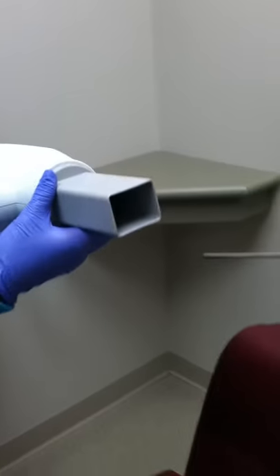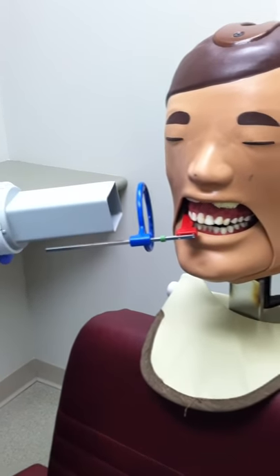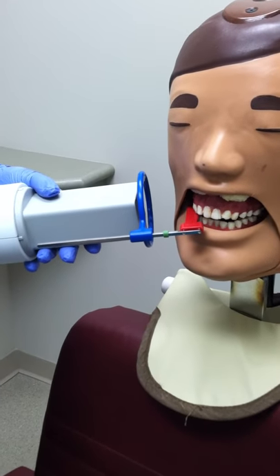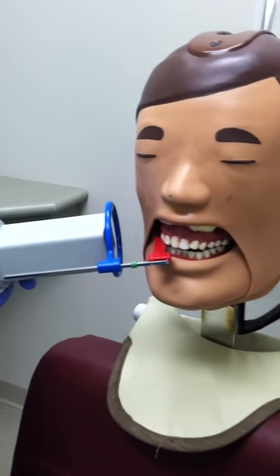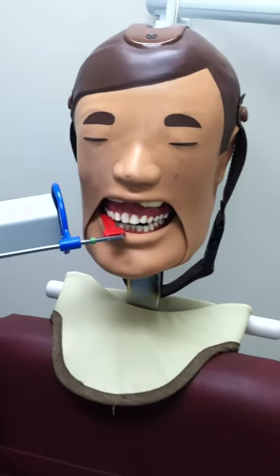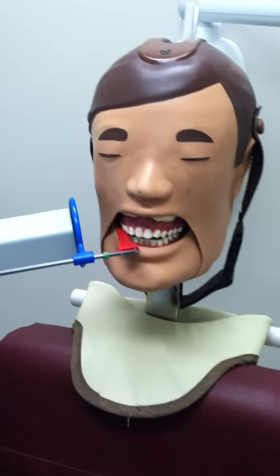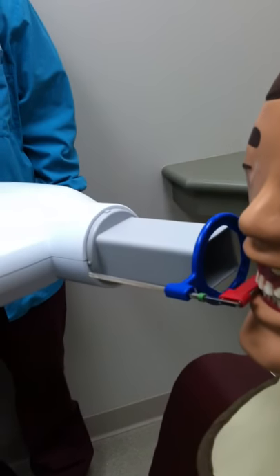The angles used when placing the tube head should be a horizontal angle parallel with the contact between the maxillary second premolar and first molar, and a vertical angle of plus 5 to plus 10 degrees. This allows for the contact between the maxillary first molar and second premolar to be open. The XCP helps with these angles by allowing the tube head to fit into the notches and having the tube head parallel with the steel rod.